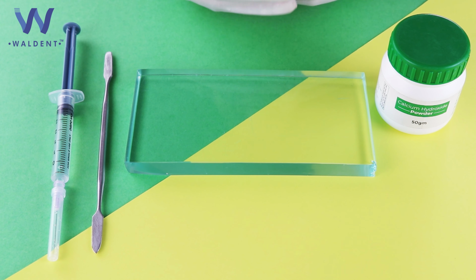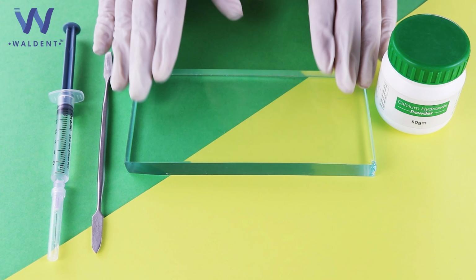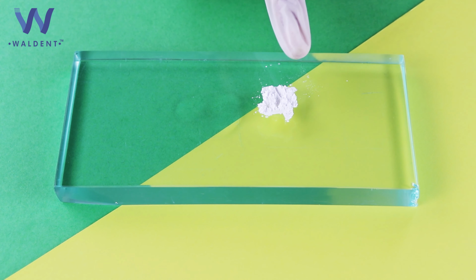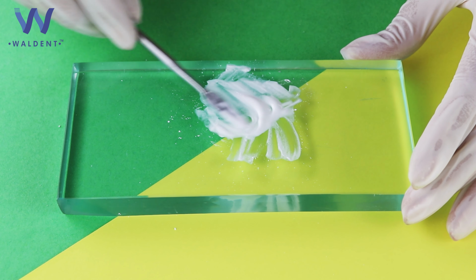The armamentarium required for the mixing of Waldent calcium hydroxide powder are Waldent calcium hydroxide powder, a cool glass slab, a mixing spatula, and normal saline. Take an approximate quantity of Waldent calcium hydroxide powder and normal saline on a cool glass slab and mix to a creamy consistency.